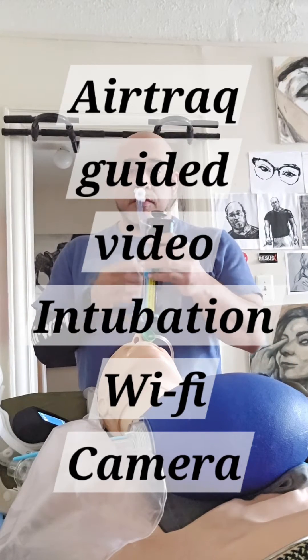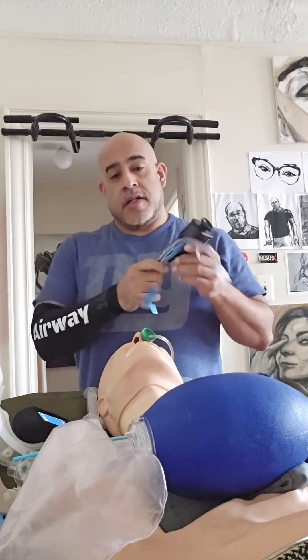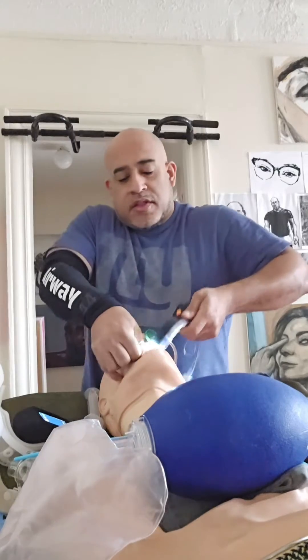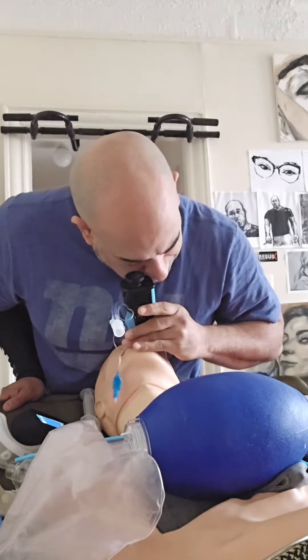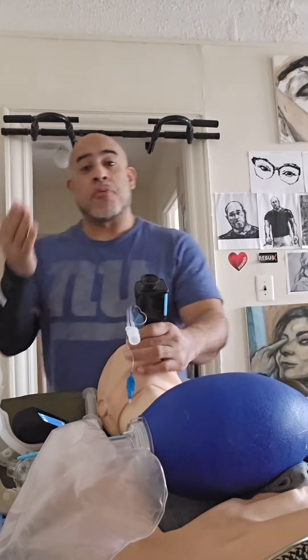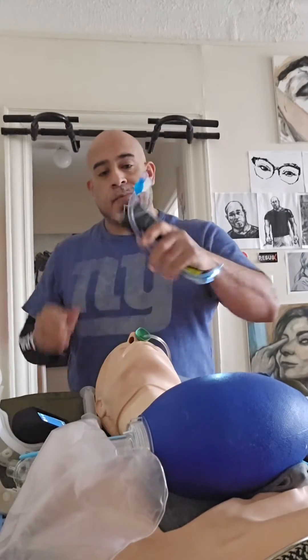The reason people don't like to use a device like this is — despite the fact that if it's correctly used you can still intubate — you have to bend over. People like to go in the coffin position, bend over, and look through the eyepiece. But if you look through the eyepiece you may not see and focus what a person with normal vision at normal age would want to use. So the cure to this would be some kind of adaptation.